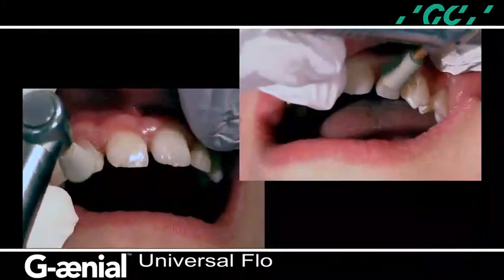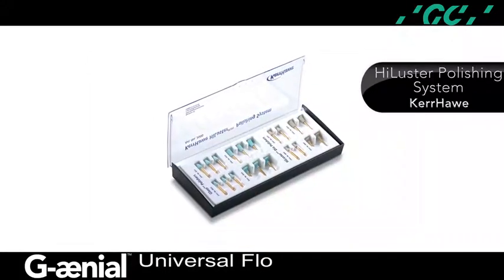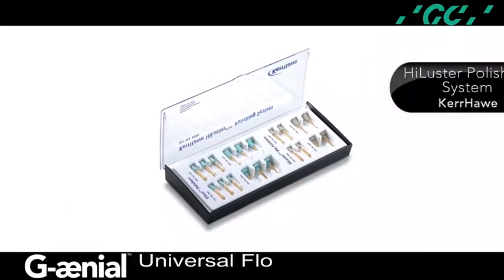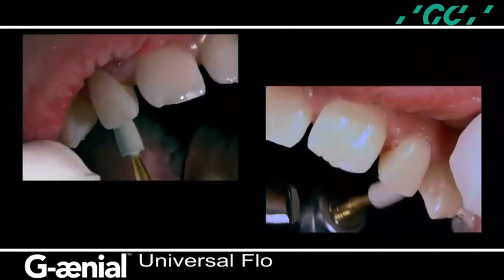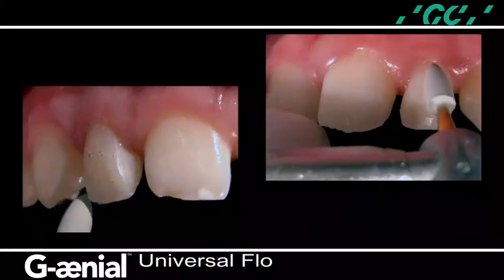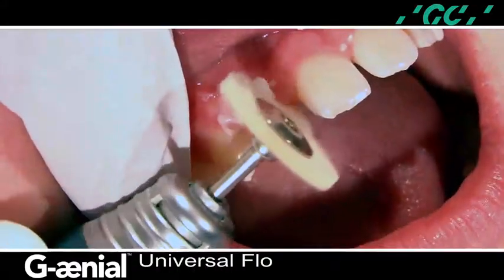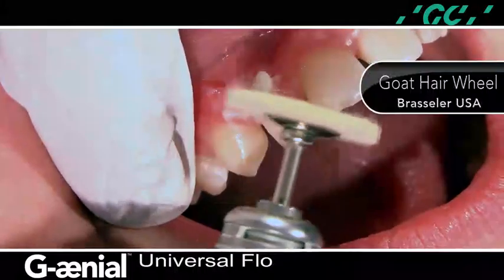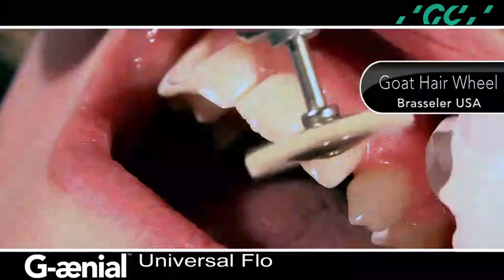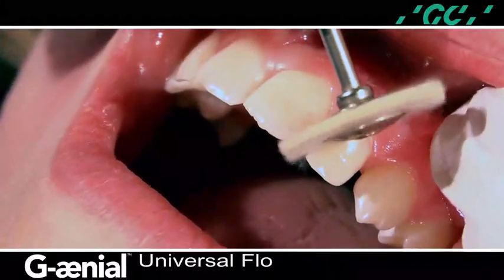The gingival and facial region is smoothed and polished with a high-shine silicone hollow cup using the high-luster polishing system by Kerr Hawe. Polishing of the facial surfaces is accomplished with a high-shine silicone point using the high-luster polishing system by Kerr Hawe. A loose abrasive diamond composite polishing paste and a goat hair wheel are used at slow speed, approximately 4,000 to 6,000 RPMs, to impart a high surface luster.